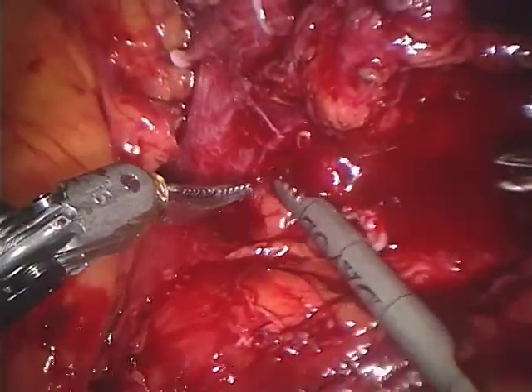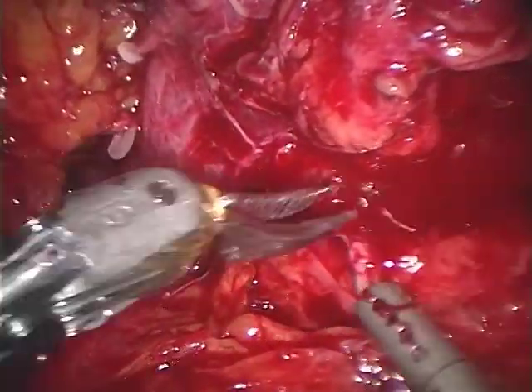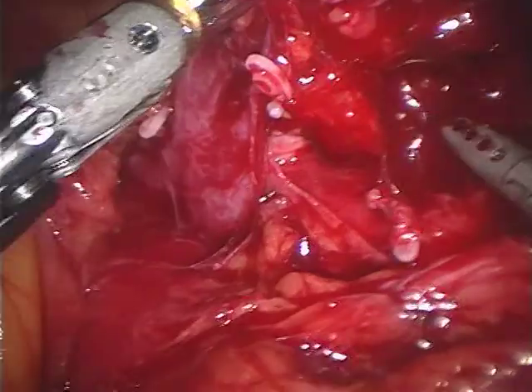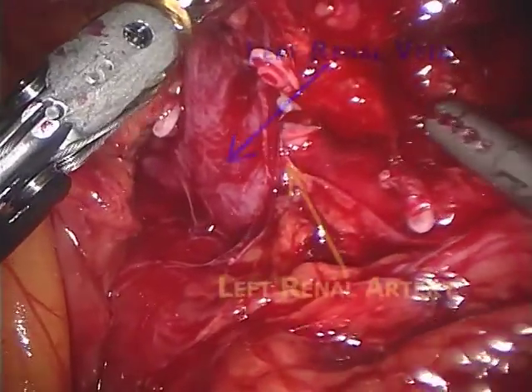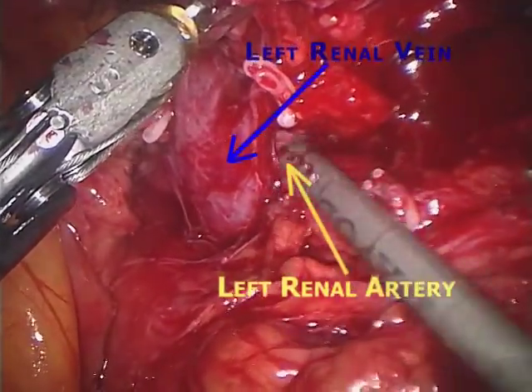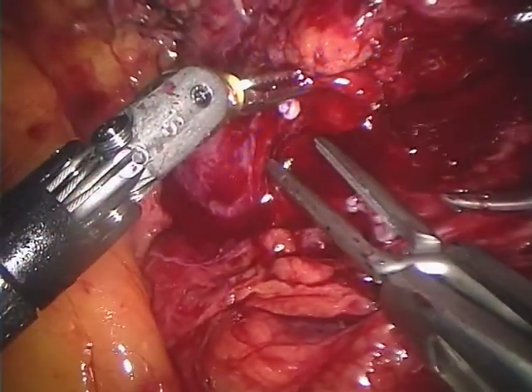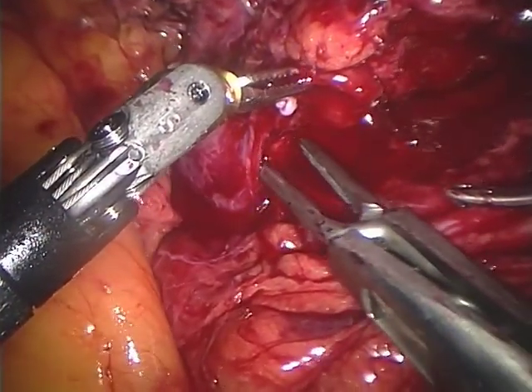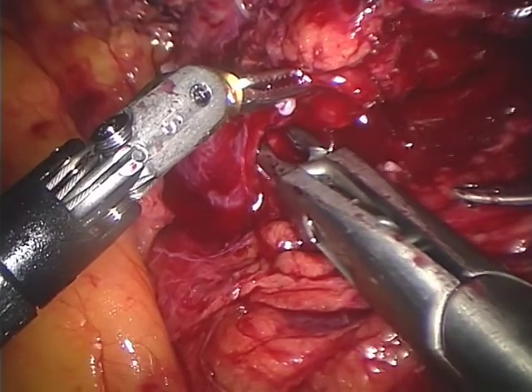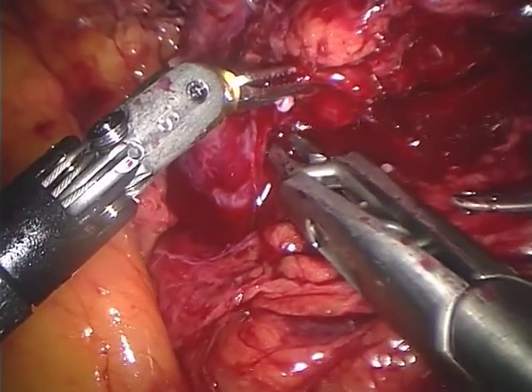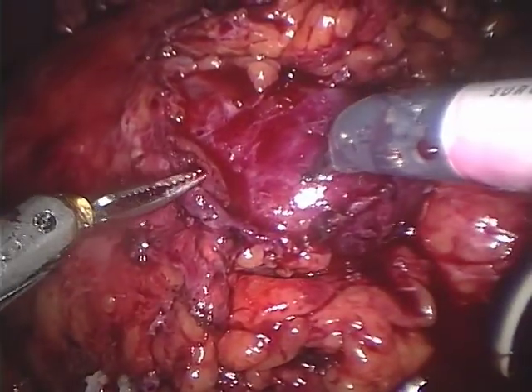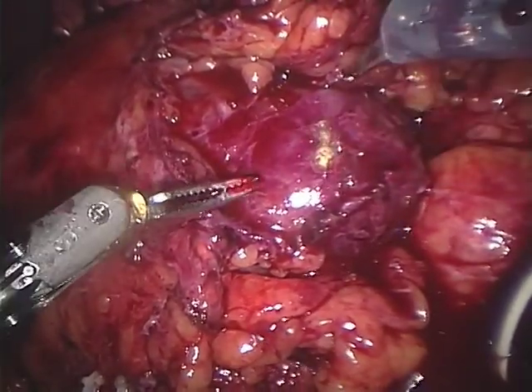Now the hilum is dissected from all surrounding structures. Here you see the renal artery, just posterior to the left renal vein. The artery is being clamped in preparation for the lower pole amputation. Prior to clamping the artery, an ultrasound probe was used to identify the level of the lower pole calyx.